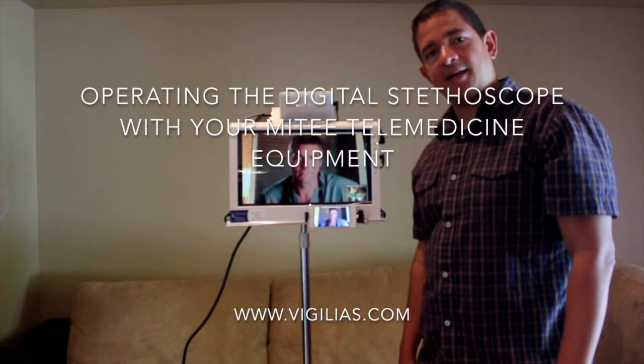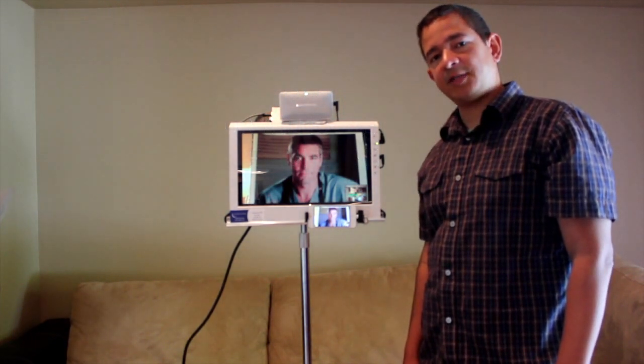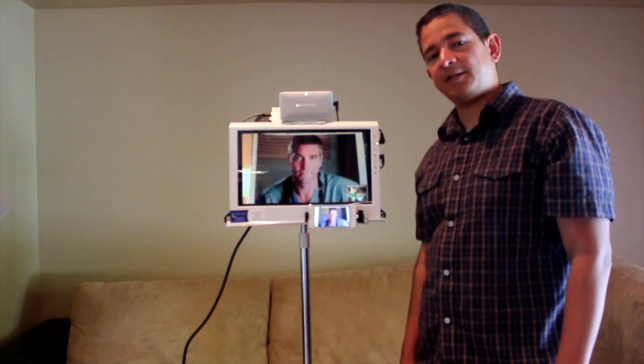Hello, this is Zana, the tech guy at Vigilius. Today we're going to go over how to use our digital stethoscope to do telemedicine auscultation.